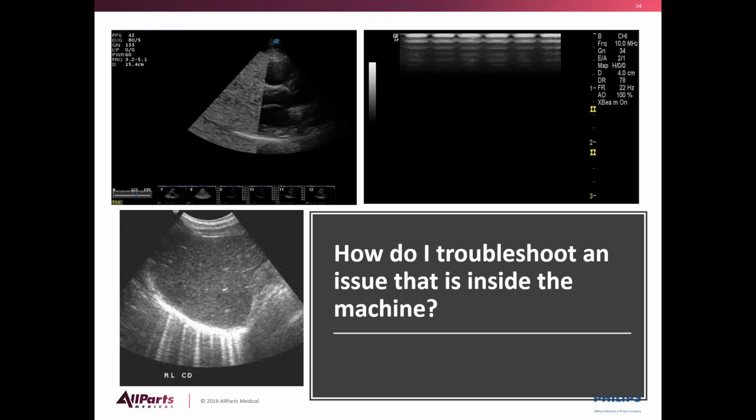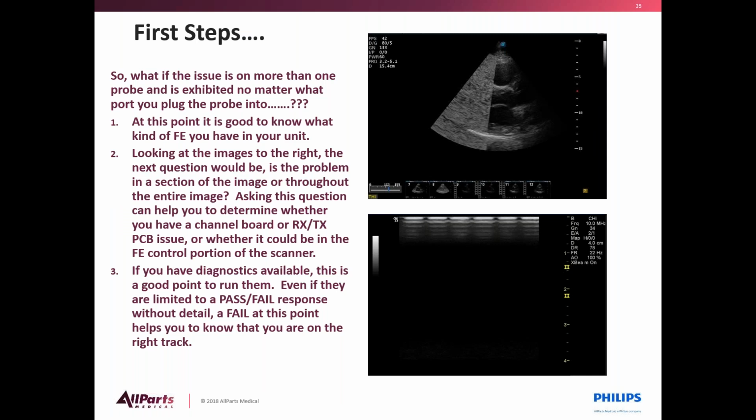So now let's take a look at how to troubleshoot an issue that's inside the machine. So what if the issue is on more than one probe and is exhibited no matter what port you plug the probe into? At this point, it's good to know what kind of front end you have in your unit. That's kind of why we went through the front end breakdowns ahead of time.